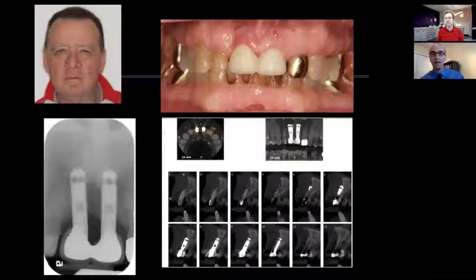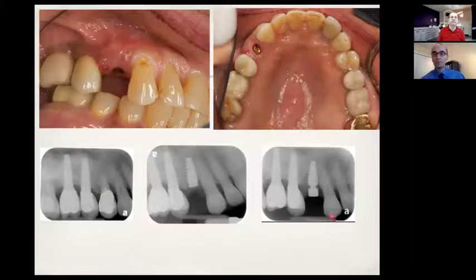So would you just point to that again there with your cursor and just highlight it? Sure. This is the area of bone loss 2 months after insertion of the healing abutment, or doing the second stage surgery. So this is a tremendous amount of bone loss.